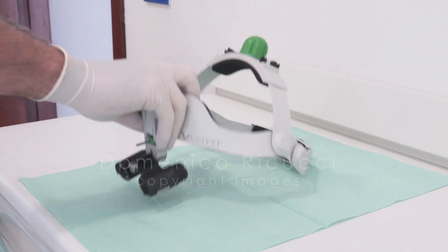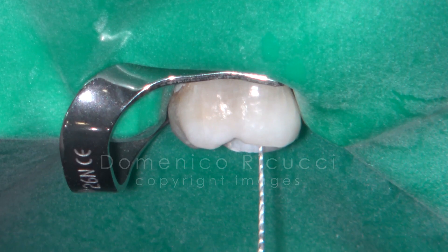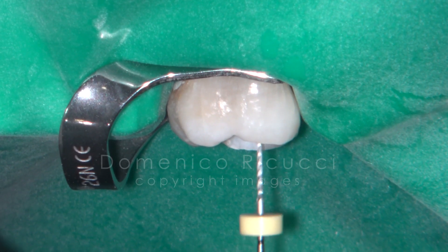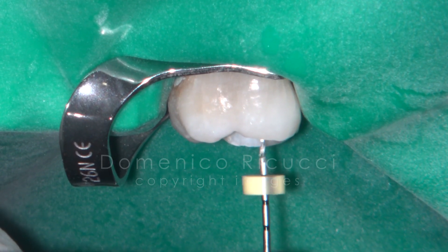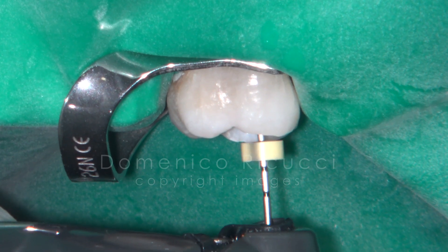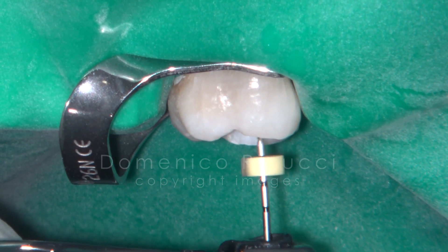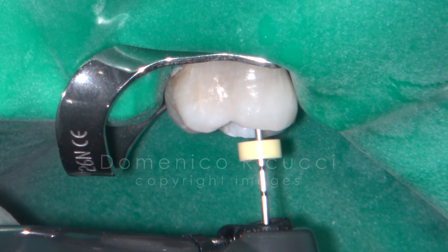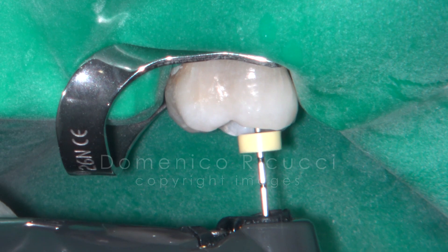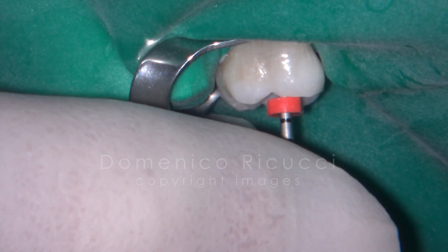Use another magnifying device and position yourself in a way that you can clearly see at 90 degrees the relationship between the reference point and the rubber stop.